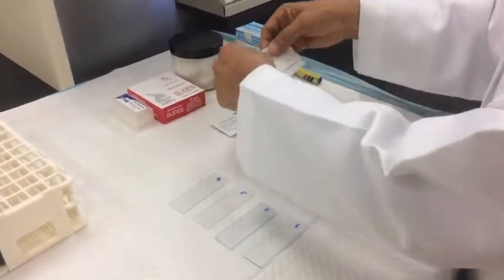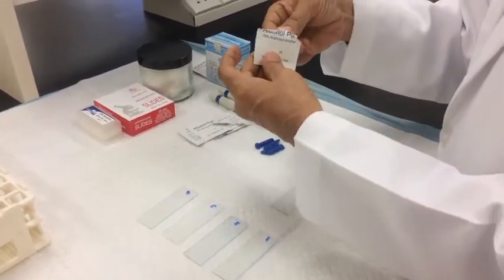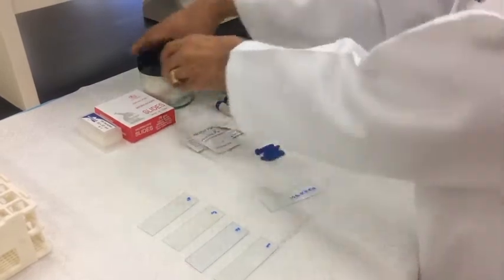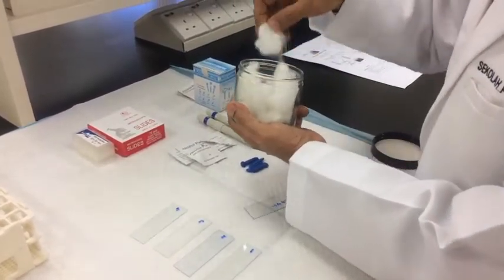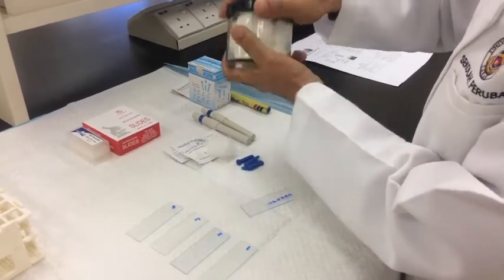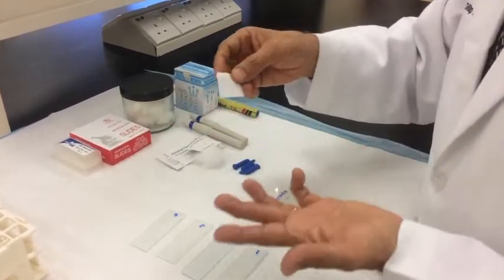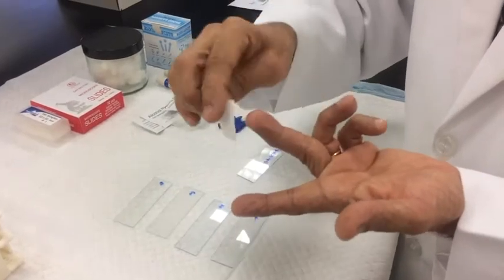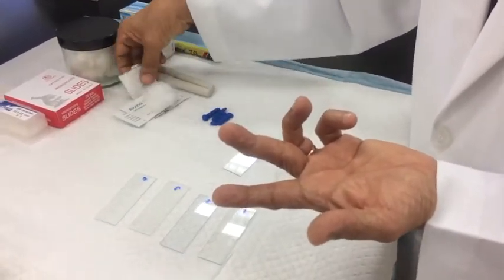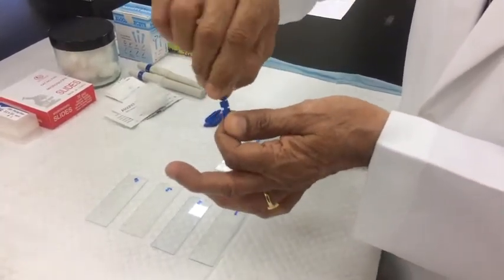First, take an alcohol swab to clean the fingertip. Keep a cotton piece ready to stop the bleeding. Apply the alcohol swab to the fingertip and allow it to dry. Then take the sterile lancet and break the tip.